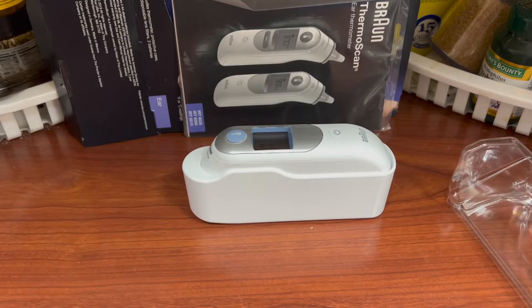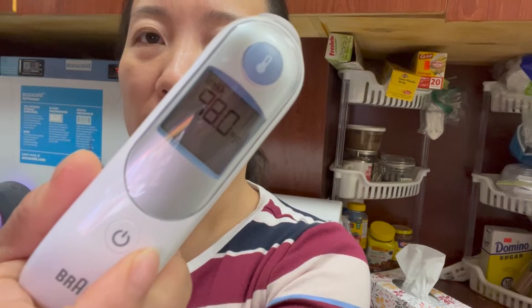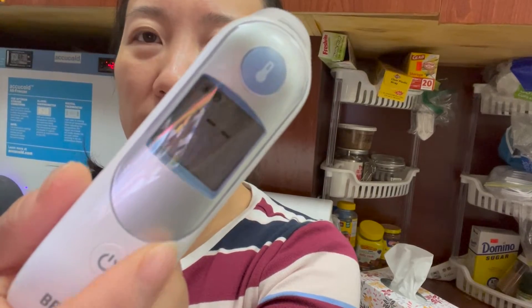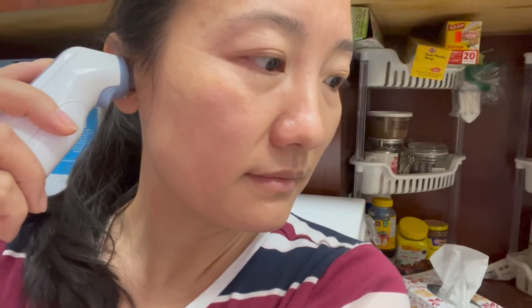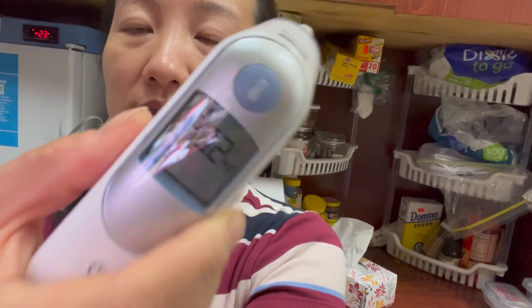Let's try it. Press the on button right here, and wait for three lines. So the machine is set. Now put it inside your ear as far as possible, don't worry, and press this button. When you hear a beep, hear the result: 98.2. No fever.